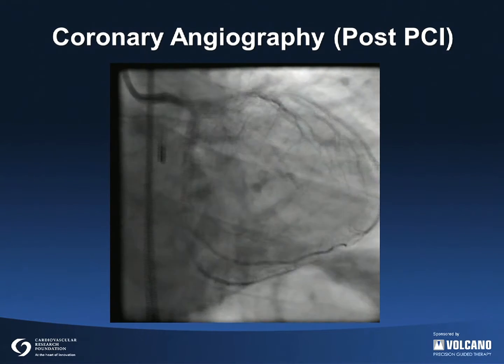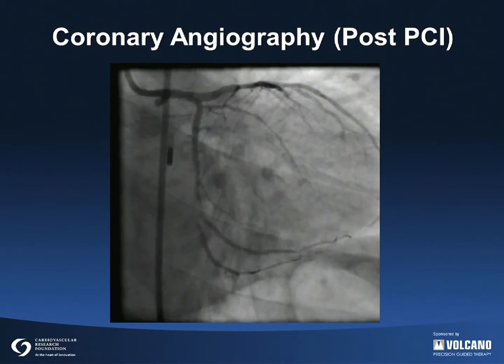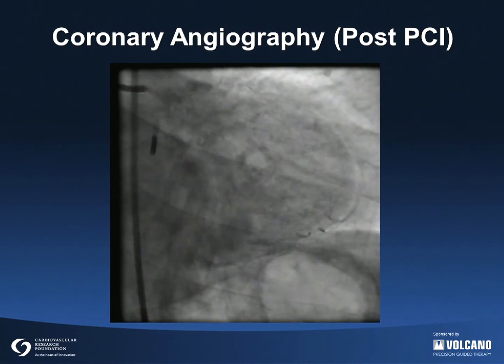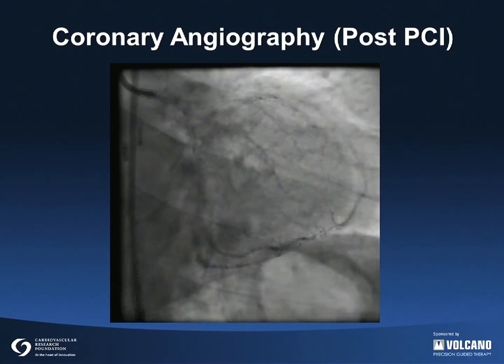Final kissing balloon inflation was done using a 3.5 millimeter non-compliant balloon in the LAD and a 3 millimeter non-compliant balloon in the left circumflex.